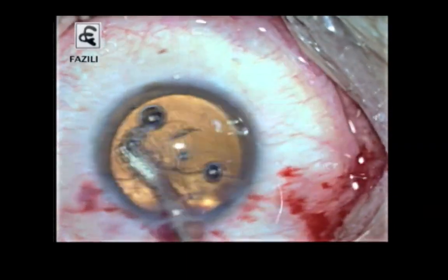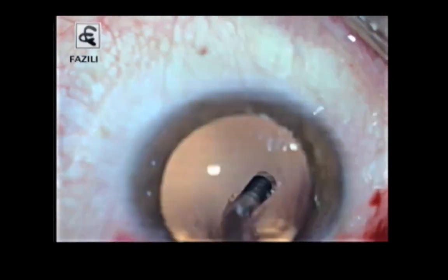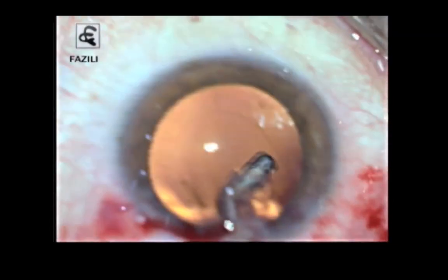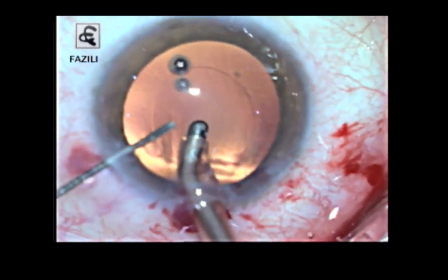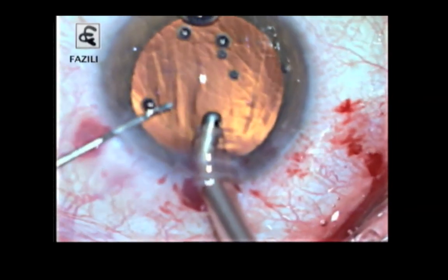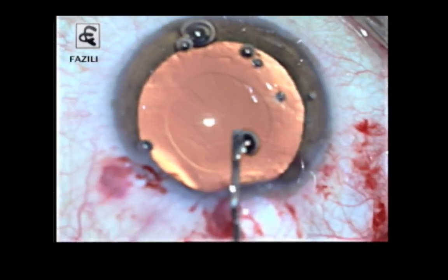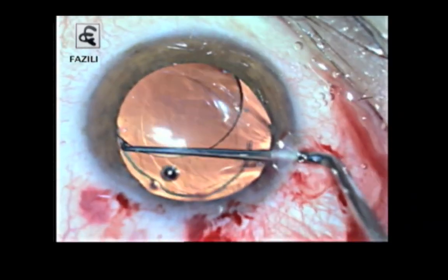It's also important to remember that another most important thing in myopes is that you should be doing a neat, clean cortical cleanup, because if you leave cells there, the need for YAG capsulotomy is early. You can see again before the IA probe is taken out after a good, clean, thorough cortical cleanup, I'm just injecting viscoelastic again, and then putting some more through the main port.